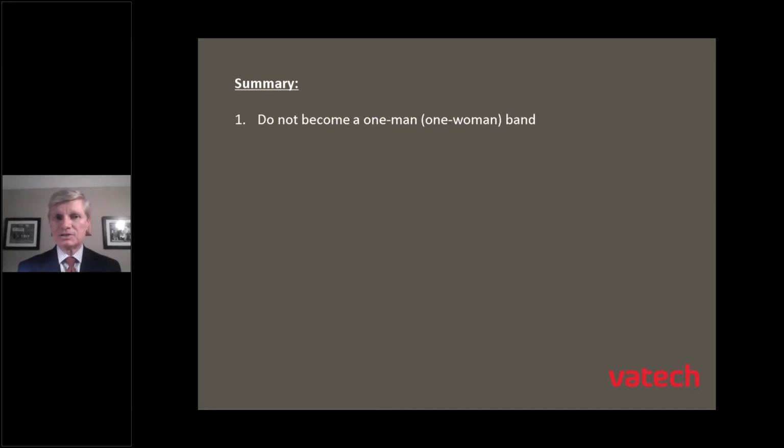So in summary, what we talked about is don't become a one-man or one-woman band. It's absolutely essential to get everybody engaged in your office to participate, to help support educating your patients, get better cooperation, and make it more efficient for you to image capture, diagnose, treatment plan, and then present to your patient. It's also essential to implement proper image capture protocols. This extends to 2D, but certainly to 3D as well. Make sure the team capturing images understands the proper protocols, because the more they can do to minimize movement of the patient, the greater stability they have, the better output you're going to have.